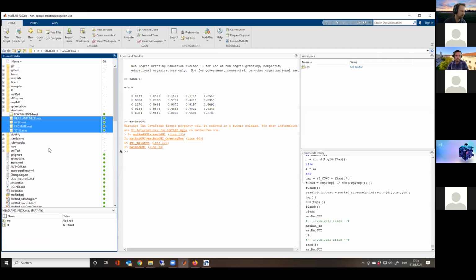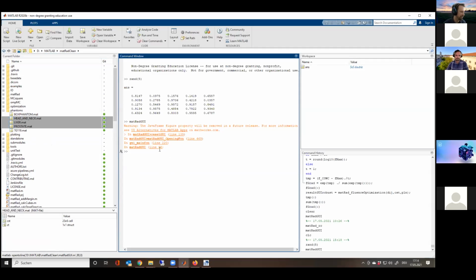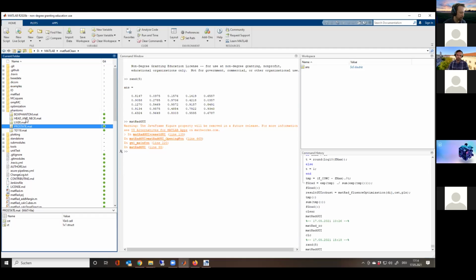It's freely available files. These are actually patients, or let's say not necessarily patients. They are voluntary humans that decided to put themselves in a CT scanner and let their body be imaged. I'm not sure if all of them, but I think all of them don't really have a tumor.